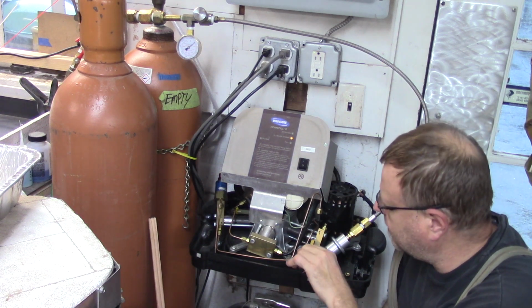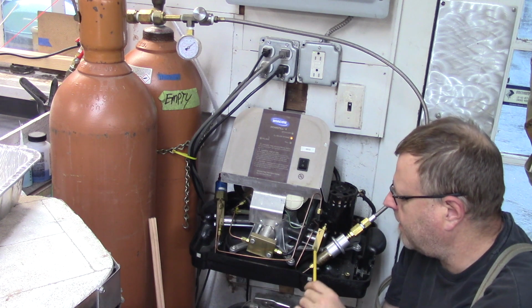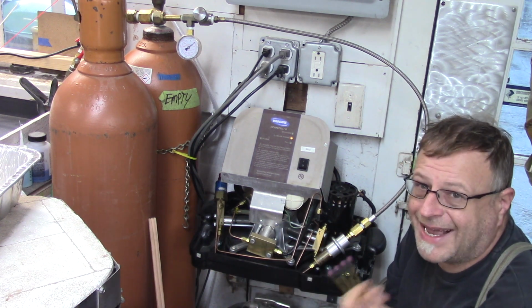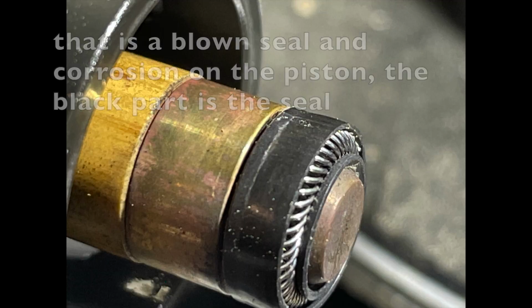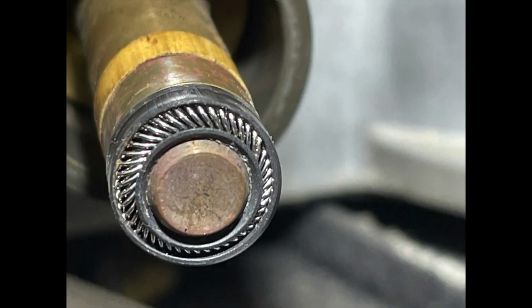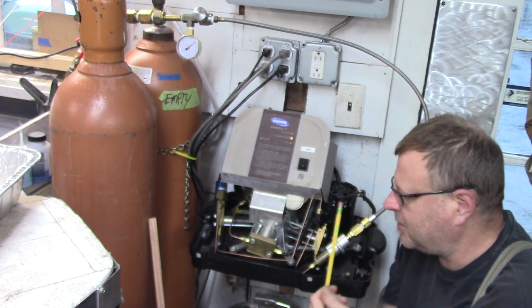When I pulled cylinder number 4 and cylinder number 5 heads off, there was a good bit of material inside of there that was the seals. I did take pictures of the seals in case you wanted to know what they look like. They're not great pictures, but they are pictures.